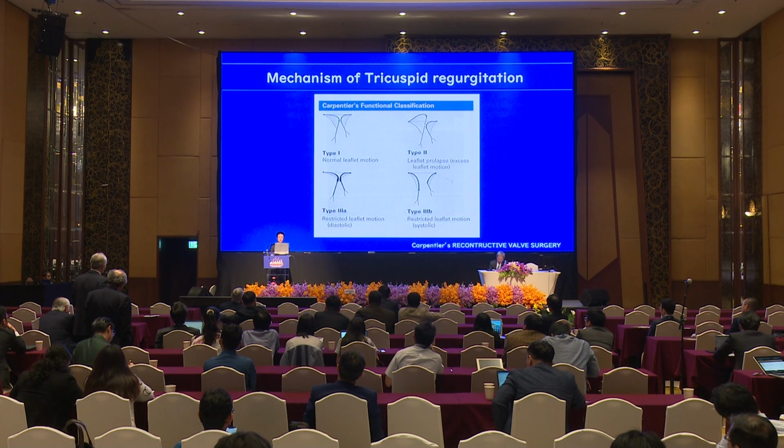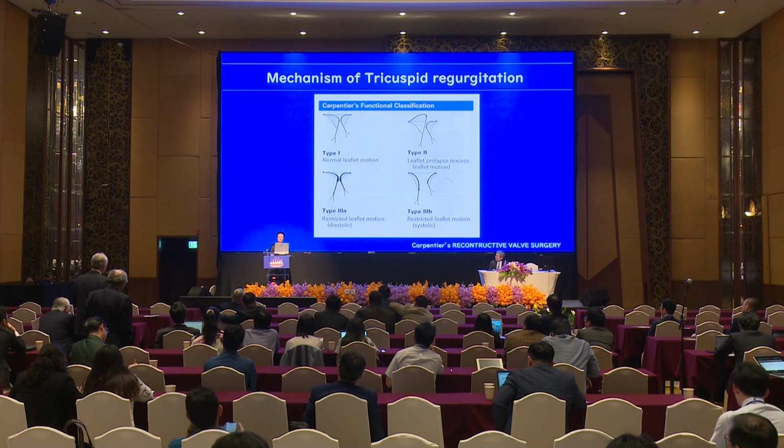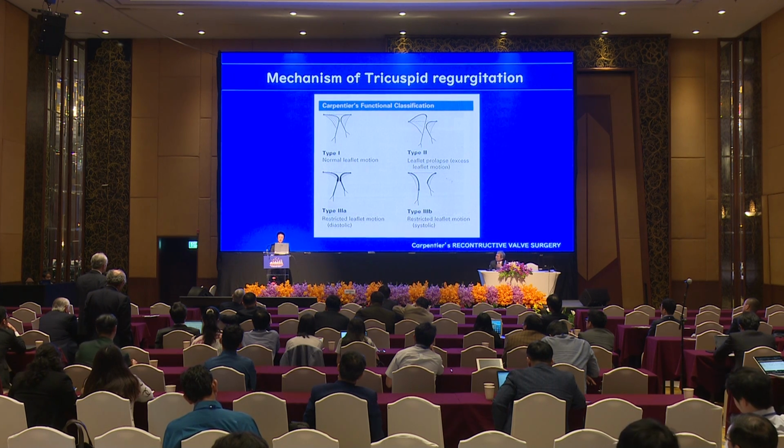In an endocarditis situation, I use autologous pericardium, because that patient had very thin pericardium, and I think autologous pericardium is safer in the endocarditis situation.